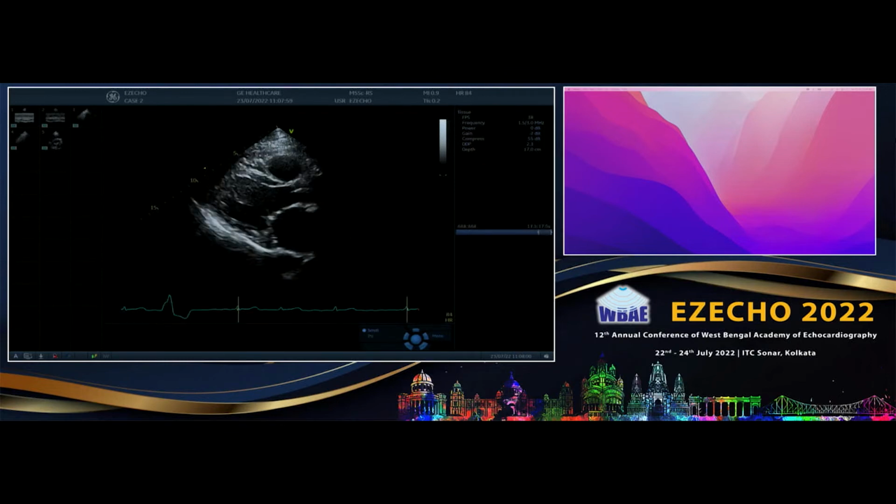Just doing the lung ultrasound. One important thing: if you do lung ultrasound, give it as a separate report and you can charge for it. I'm telling you, I'm just putting a probe, you can say whether there are A lines or B lines, and you can charge.